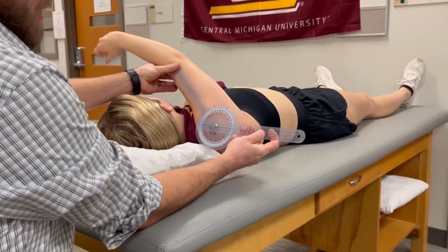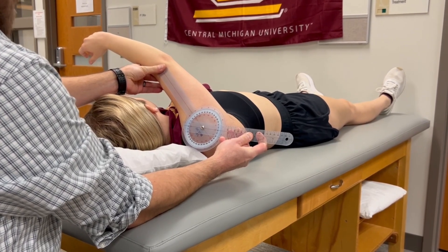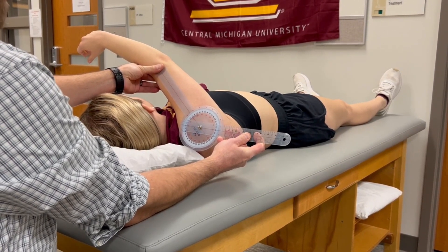The reference arm is going to be horizontal and then the indicator is going to be parallel with the humerus.